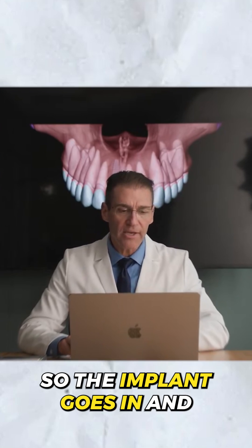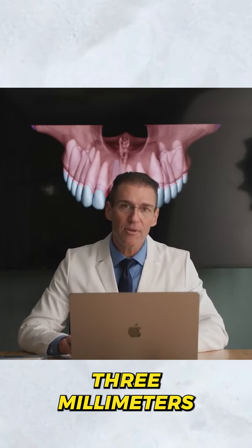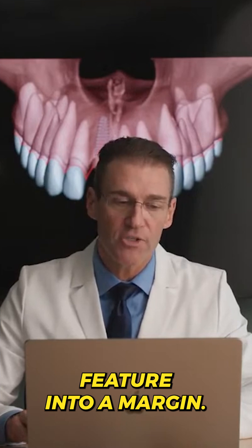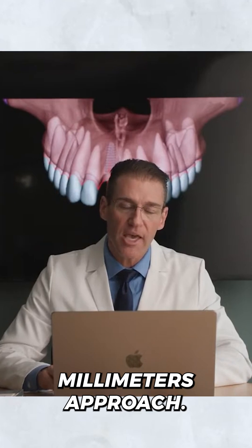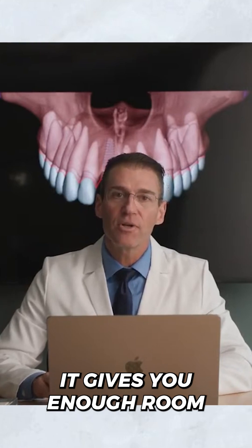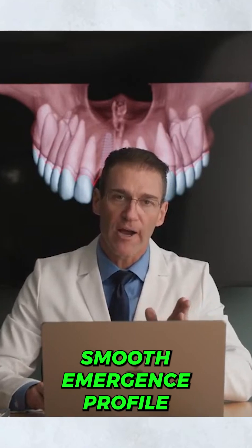So the implant goes in — and where does it go? It goes three millimeters apical to the desired free gingival margin. If you get your implant three millimeters apical to the desired free gingival margin, it gives you enough room to have run-out space and a very smooth emergence profile.